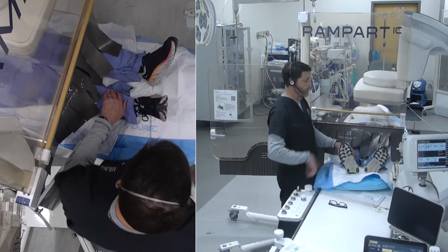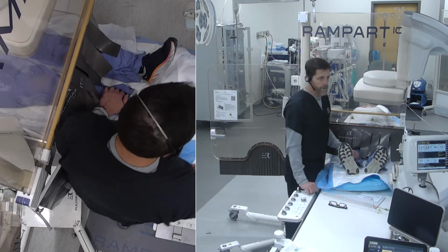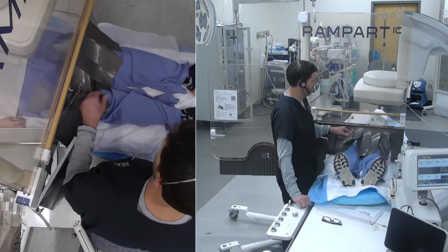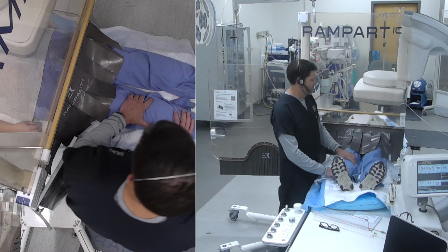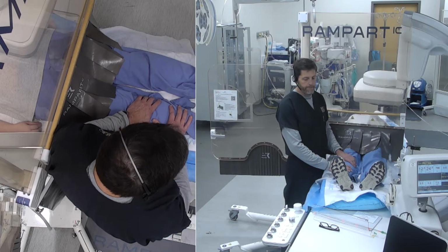Those are the accesses. If you're going pedal, we put the patient in the normal position. If you're going from the right leg over to the left leg, the patient is in the normal position. So that's how those are done.